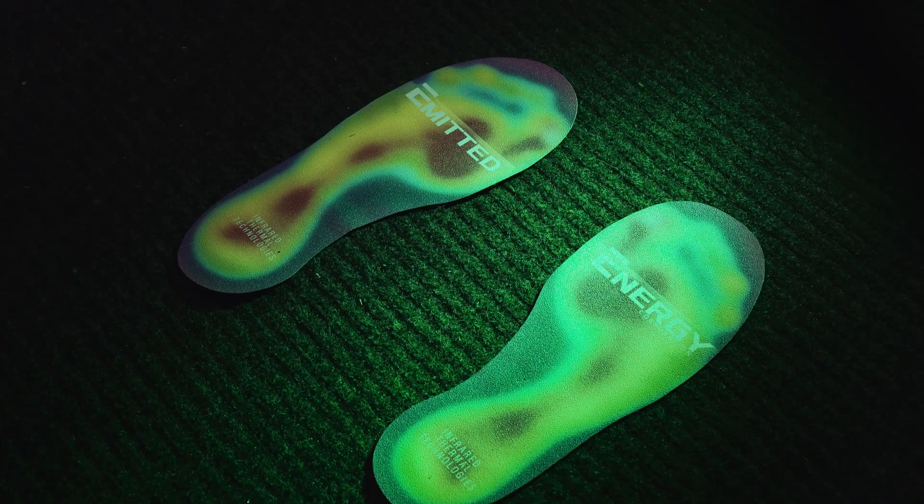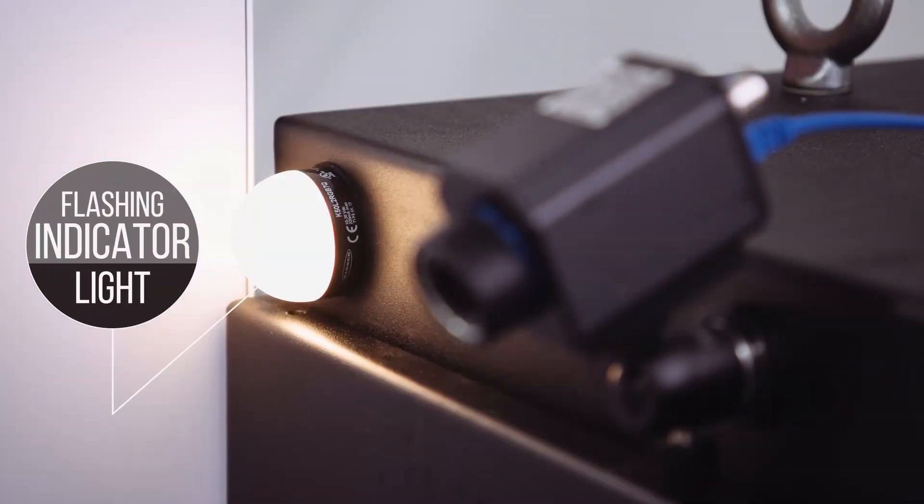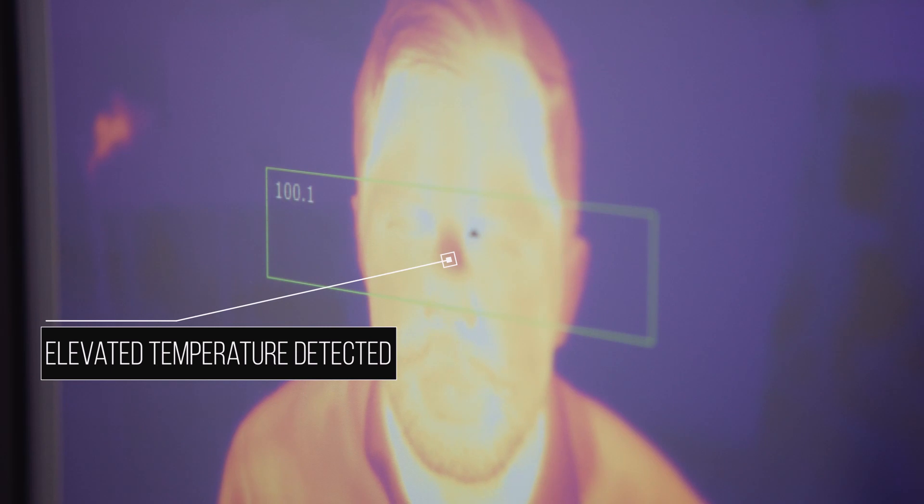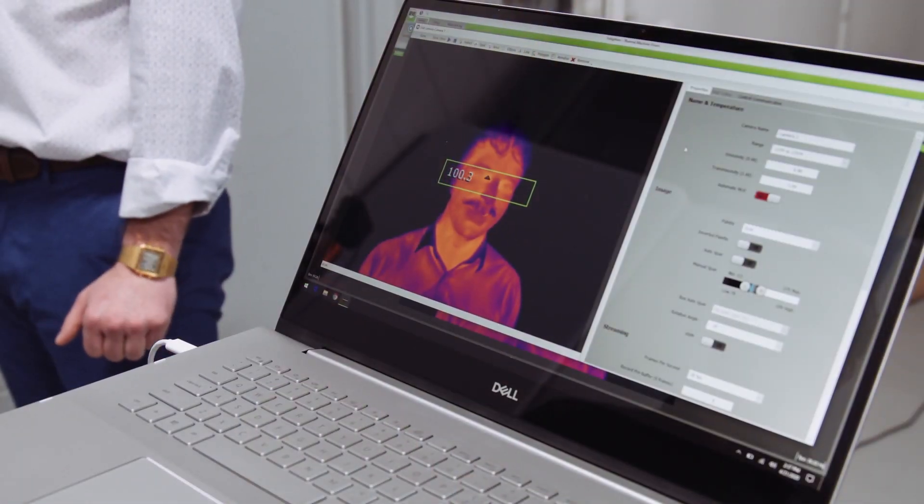The Advisor shines a light on the floor, suggesting where the subject should stand. Once the subject is positioned, the Advisor will flash a yellow light three times before displaying a green or red light. Green indicates the subject is within the correct temperature range. If the subject has an elevated temperature, the Advisor will give them a red light for additional screening.